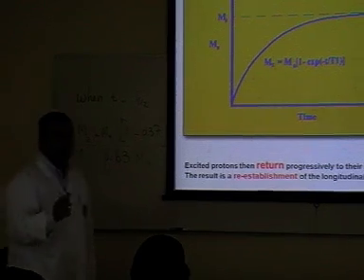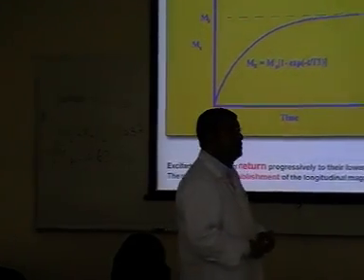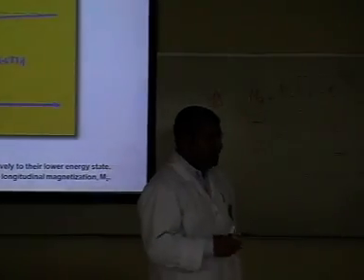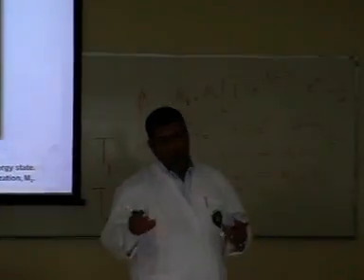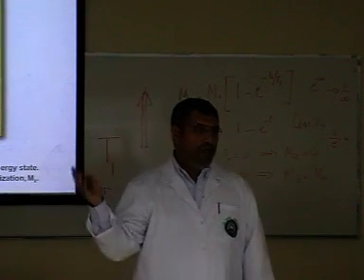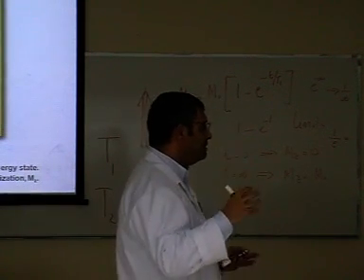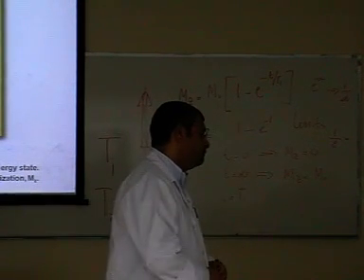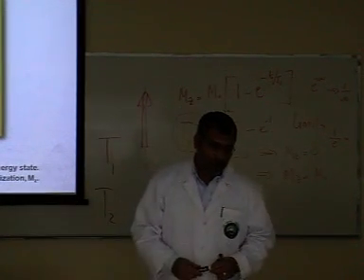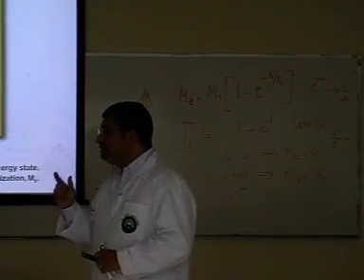Somebody, the definition of T1, capital T1. It's the time taken for the longitudinal signal to reach 63% of its initial value. Okay, you get that? Well, I want somebody else to repeat it. Now I said it, I want somebody to repeat this.